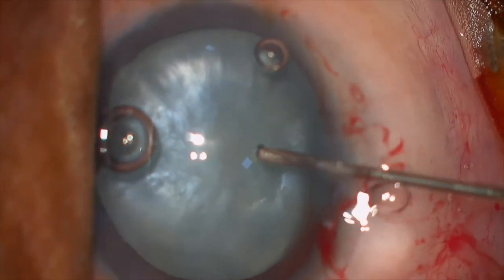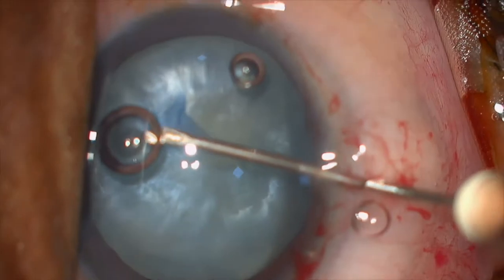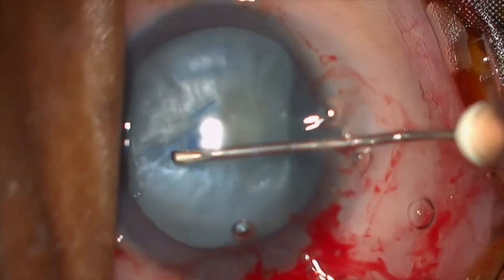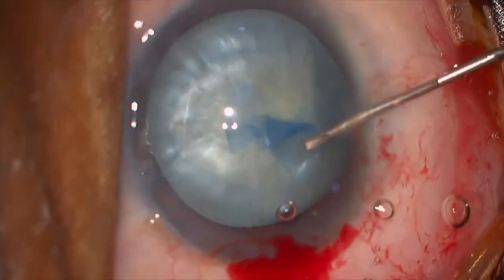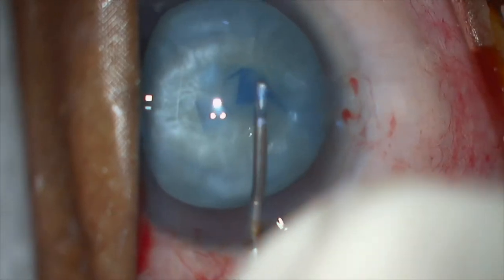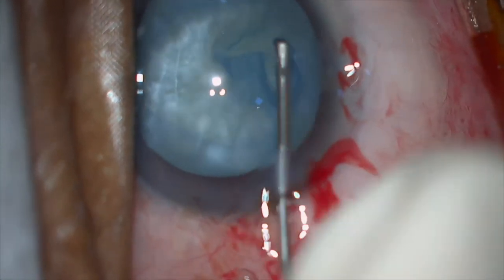Once that step is done, the rhexis can be initiated with a cystitome or a capsule rhexis forcep. The shearing and ripping force should be used together so that the rhexis is always pulled towards the center of the nucleus. The size of the rhexis will also be adequate — make sure that the anterior chamber is always filled with sufficient viscoelastic.